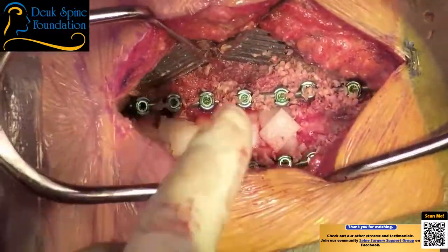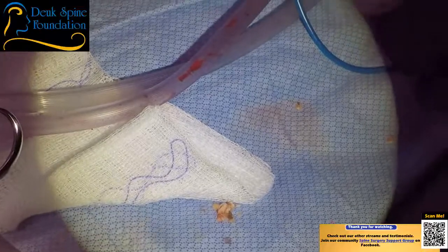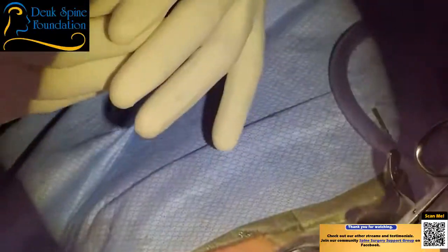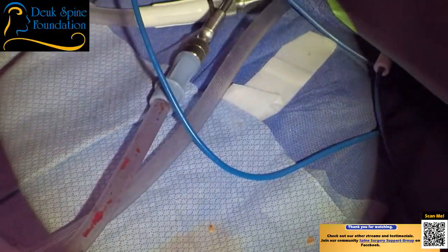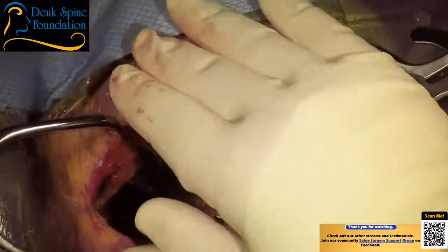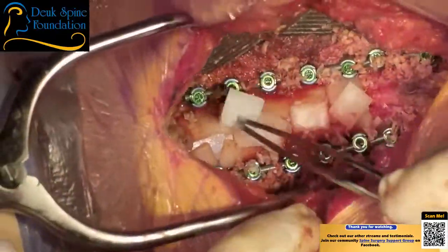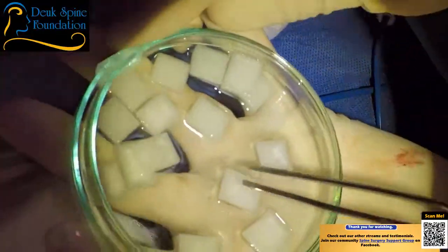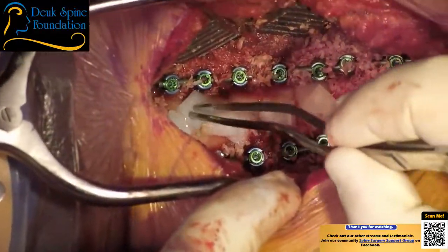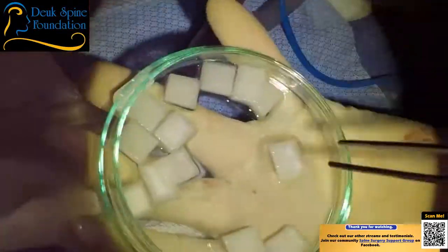So we're going to put some, wait, let's get a little more Gelfoam on there, sorry. We're going to put vancomycin, 500 milligrams, right? Yes, sir. Not 1 gram. We used to put a gram of vanc, and then we would get this localized red man syndrome on the skin. And so for the posterior cervicals, we cut back to half a gram. But for lumbar, we do 1 gram. And I think the reason is the lumbar is deeper.